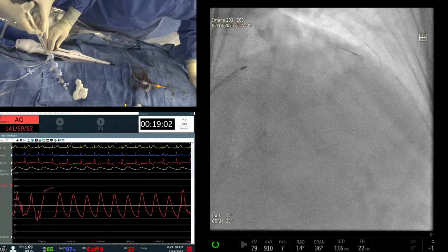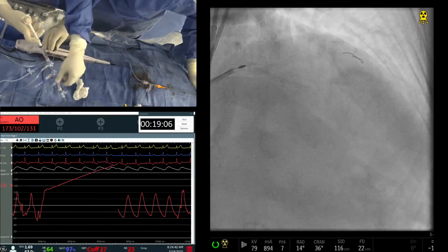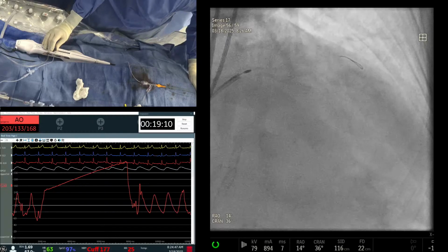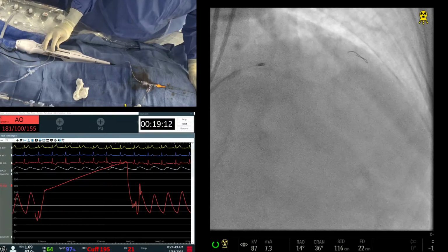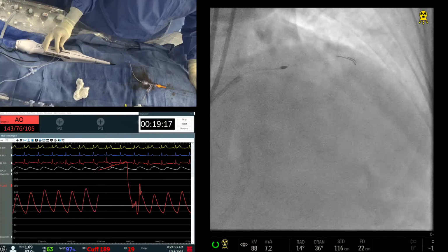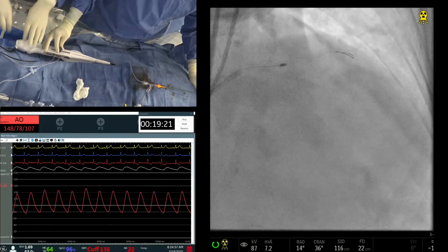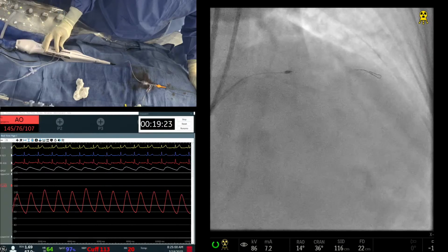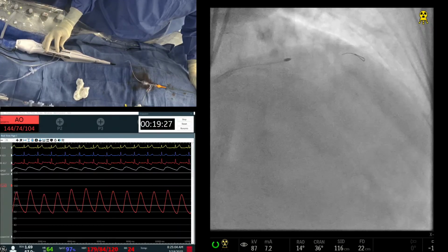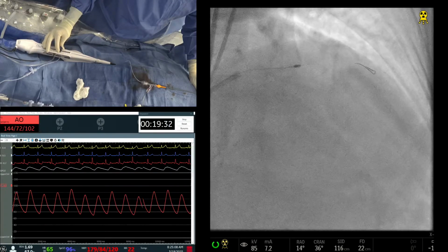I don't like the feel of that burr there. No, but there had not been much drop in RPM, which is okay. It doesn't matter, so wire bias. Yeah. It's a superior surface. And you go to 160. 160. 155. Good. Done.